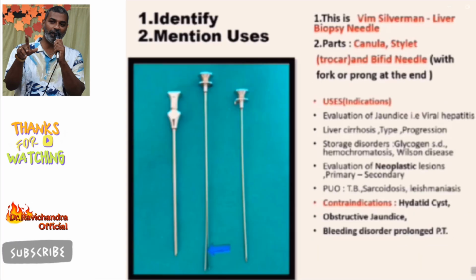Liver biopsy needle, it has cannula, stylet and bifid needle. Uses are, it is useful in the evaluation of the jaundice like viral hepatitis condition, liver cirrhosis, and it is helpful in typing the liver cirrhosis and its progression, and it is also useful in storage disorders like glycogen storage diseases, hemochromatosis, Wilson's disease, and it is also useful in evaluation of neoplastic lesions, primary and secondary.